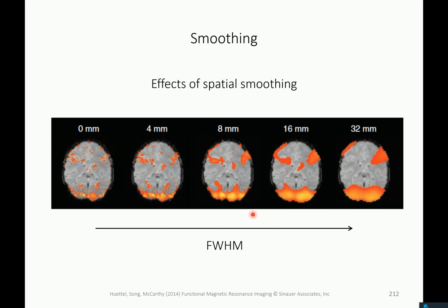Is it possible, for example, if you apply the smoothing, that you make your data not valid anymore, like if it's too much? I don't know, it's like with the sound when... Yeah, so the thing is, no. All of this data preprocessing that we discussed here is things that you can do to data, and this is all data analysis, and there is essentially no wrong or right.